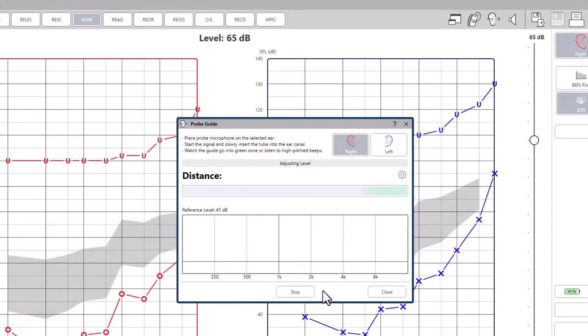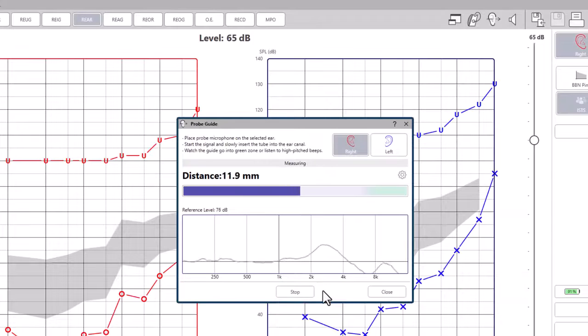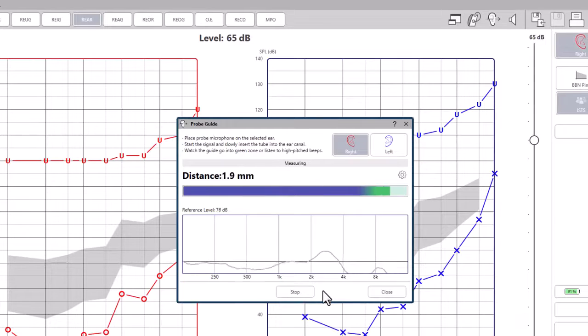The probe tube depth guide is a specialized yet easy to perform test to determine the insertion depth of the probe tube in the ear canal.